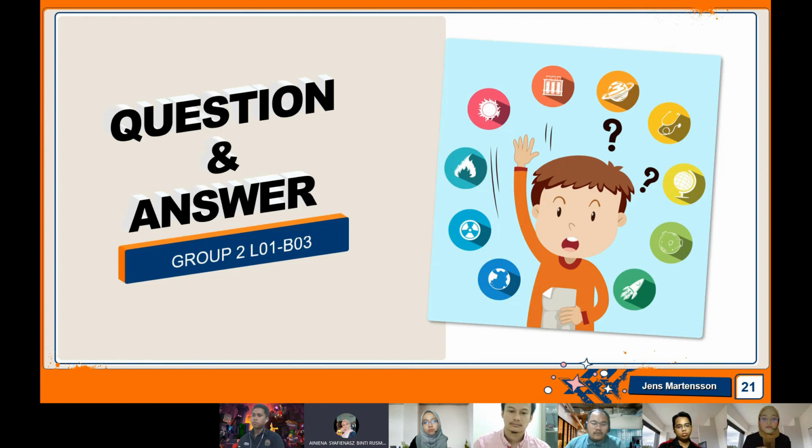So the coils help vary the magnetic field and also cover by thermal shielding to protect the patients from fluctuations in the temperature. Do you get it, Hairi? Yes. Thank you, Ainiena. Alright.